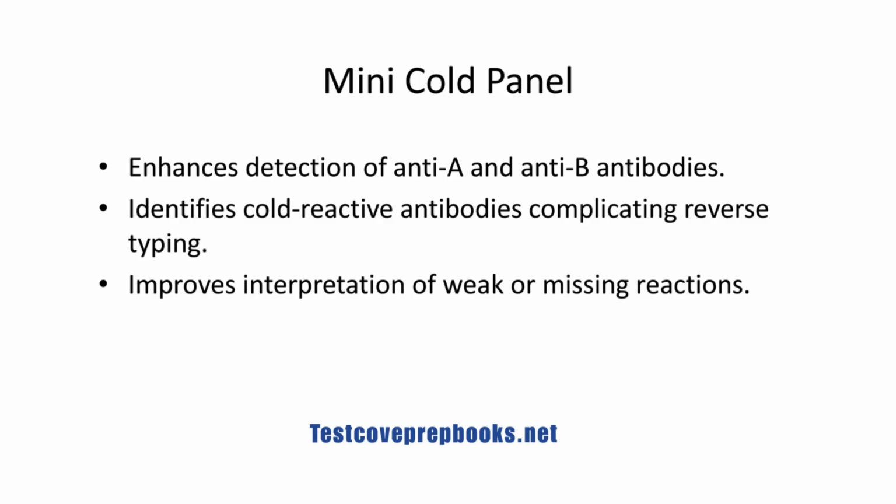These antibodies may react with antigens found on group A1 and group B reagent red cells, and their presence can complicate reverse typing results. By using the mini cold panel, laboratory professionals can more accurately interpret ABO discrepancies and ensure safe transfusion practices, especially in cases involving weak or missing antibody reactions.